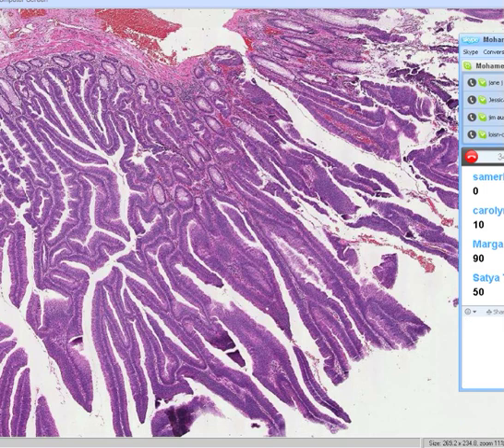I don't know because time is the big feature here, but this is a villus adenoma. And remember, I'm not going to blow this up one more time. I want you to look at these long, slender, fibrovascular cores surrounded by columnar epithelial cells. Those are the villi.